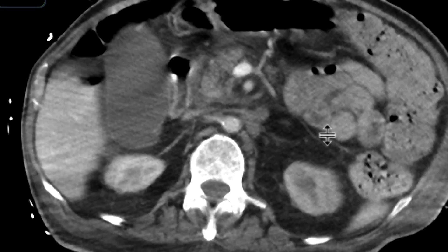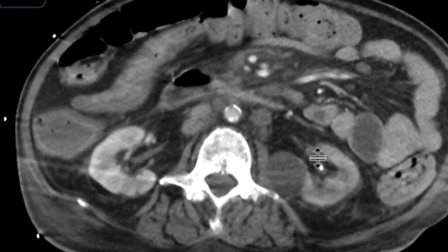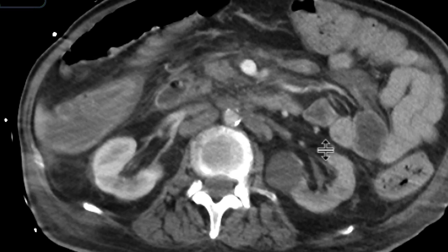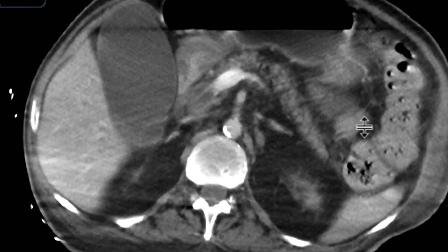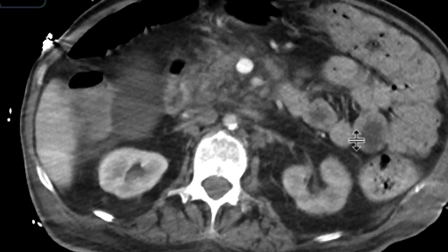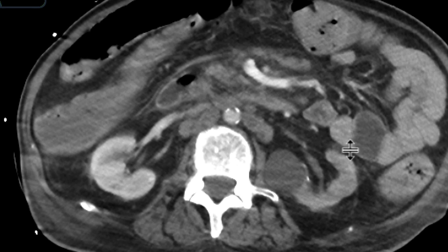One of the etiologies of diminished enhancement at times could be hydronephrosis, but there's no hydronephrosis in this instance. You also have to think of a vascular etiology — is there renal vein thrombosis? Is there renal artery thrombosis or stenosis?